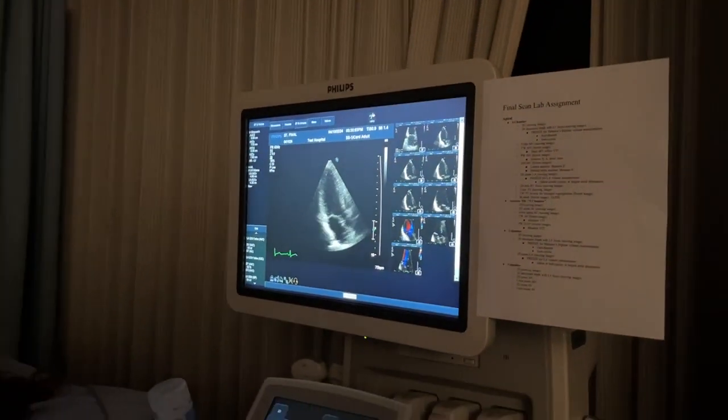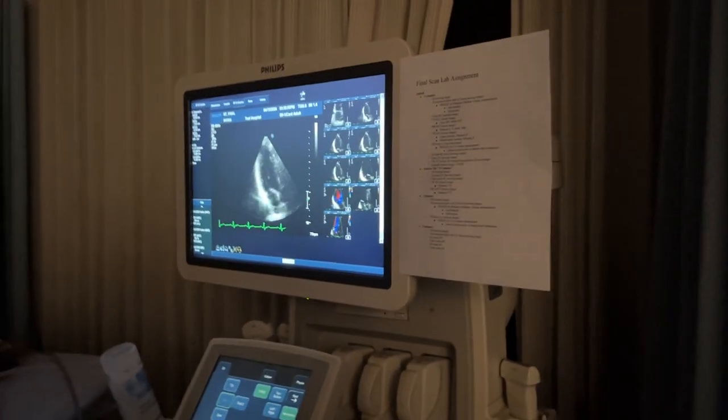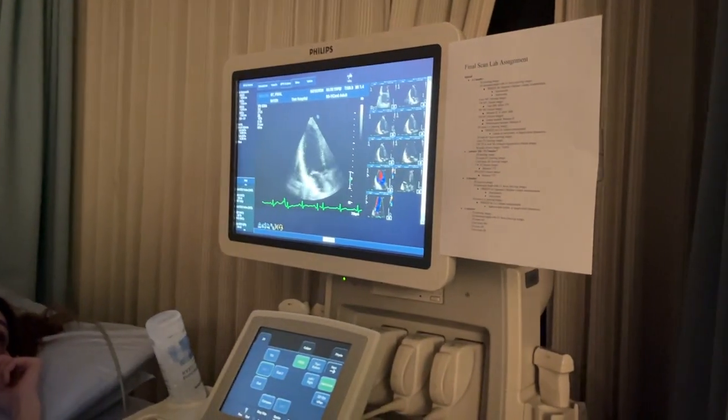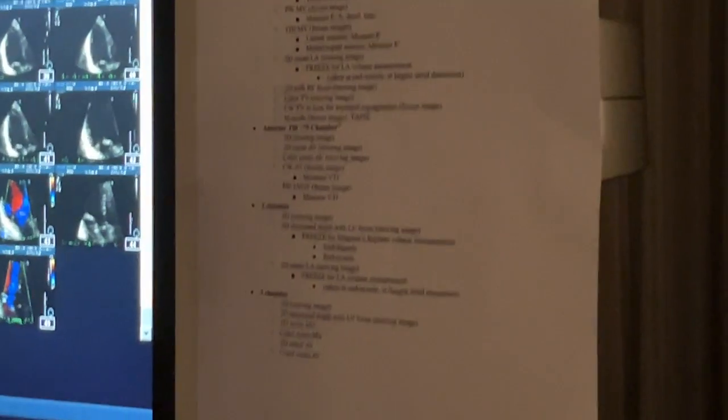That's it? Feeling good? Some color. Simpsons biplane doesn't require 3-chamber. No, it's just biplanes. So, 2 planes. Oh, okay. Yep. Oh, yeah, biplane. Duh.